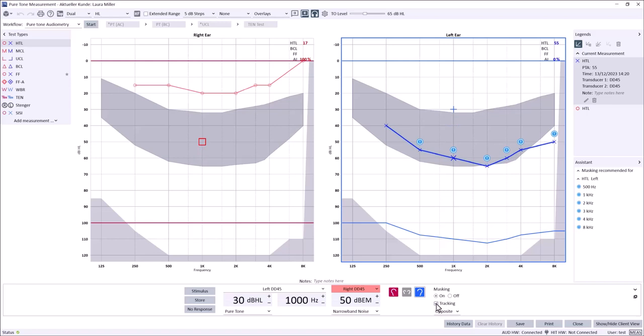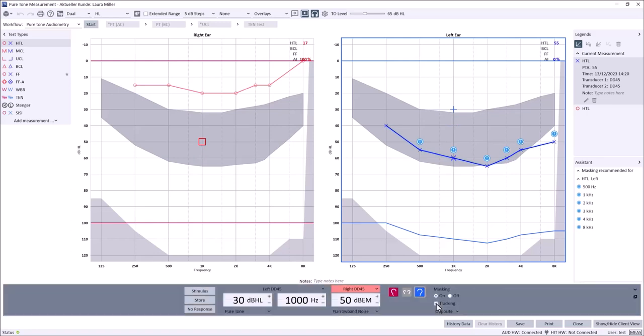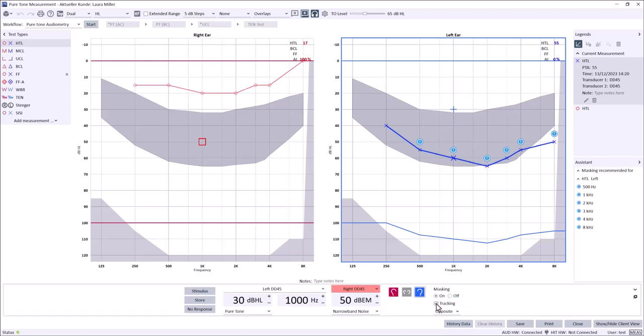By toggling on the tracking feature, masking presentation level will automatically follow your pure tone presentation level as shown here.